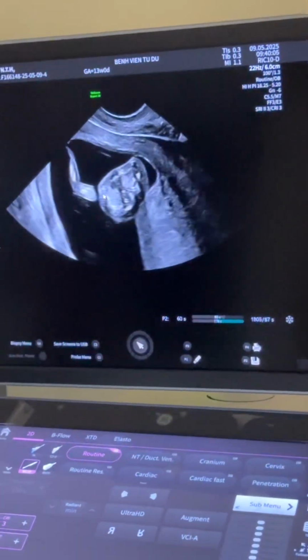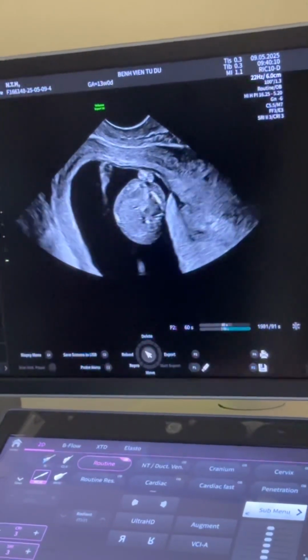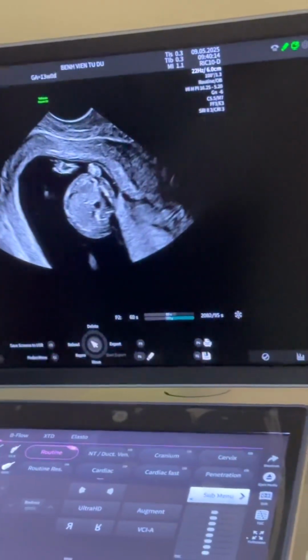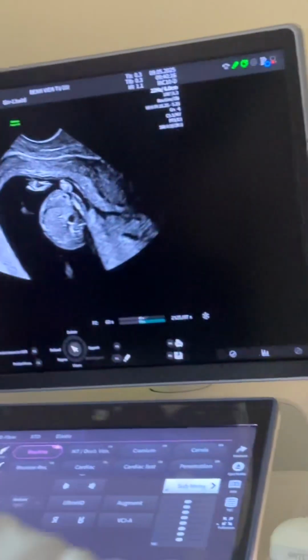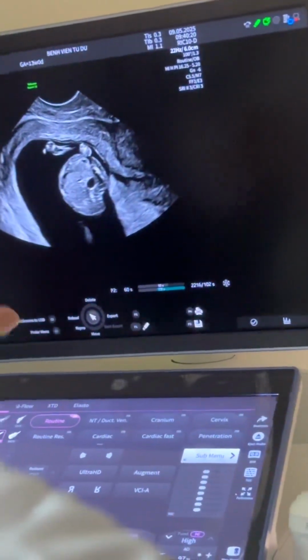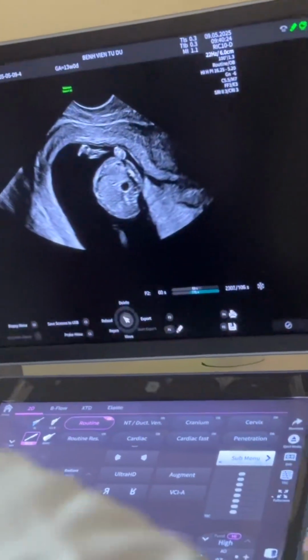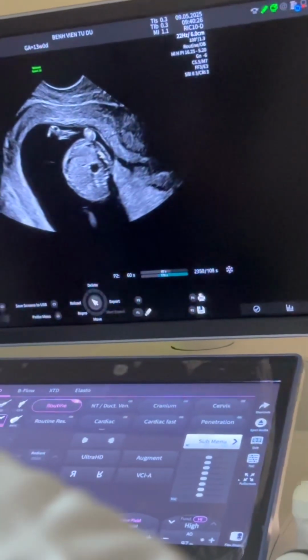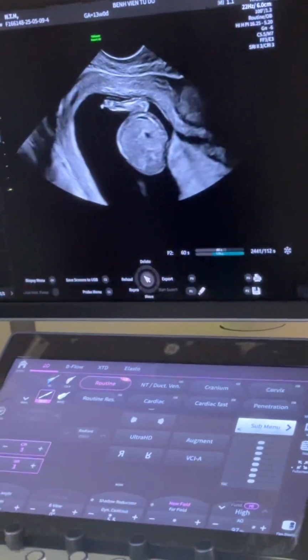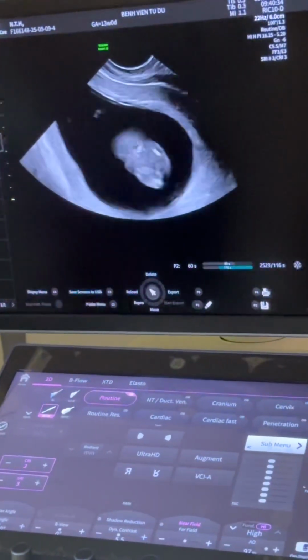So this baby, do you see the difference in the imaging when I'm looking here compared to transabdominal? It's completely different, right? So I know I did a lot of teaching in the last few minutes with you, but if I was here on my own, I would have spent very little time in that transabdominal scan, because when I looked at it, I said, the images are not good here. I would have taken a crown rump length, an abdominal circumference, a femur length. I would have spent 2 minutes, and then I would have gone to the vaginal scan. Yeah, because now I'm looking at a baby where the information that I'm getting is much clearer.